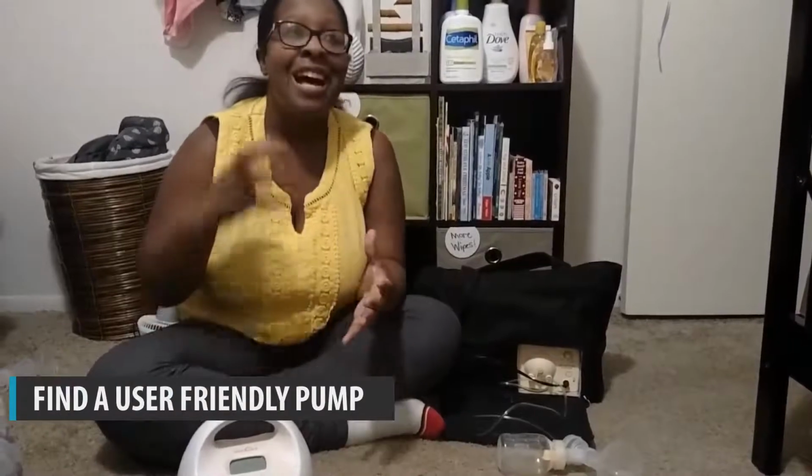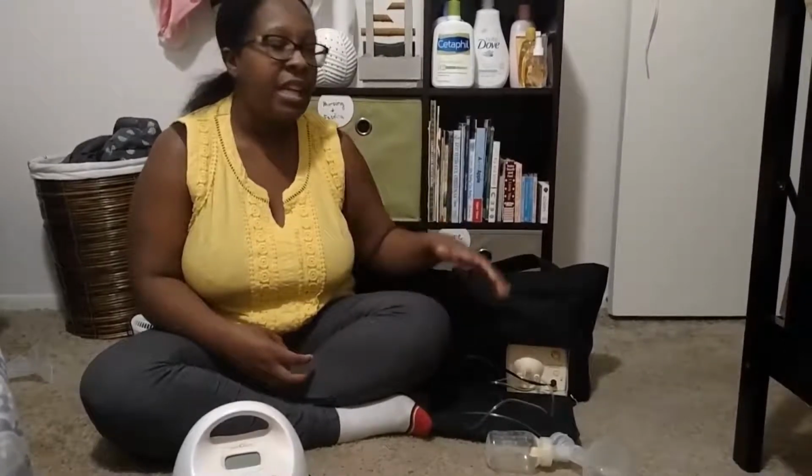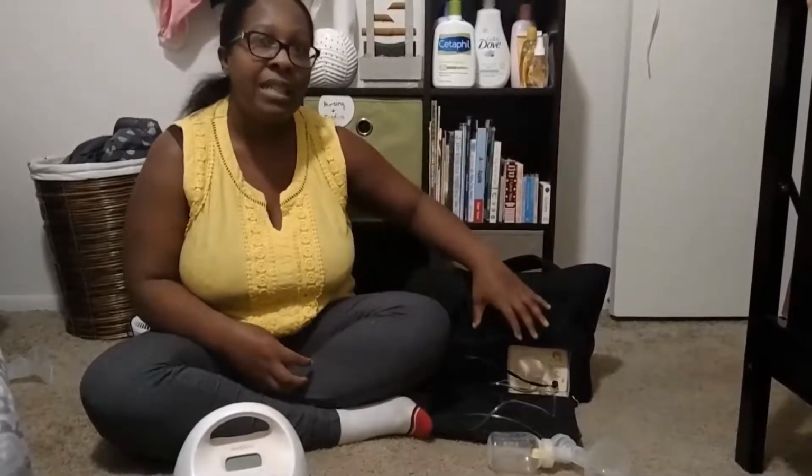Alright, what I also like about my Spectra 2 pump is just how easy it is to use. You want a pump that's fairly easy to use. I will say the Medela was pretty easy to use. They both have a letdown phase, which is really, really nice. It is very similar to what you experience when the baby's actually nursing. So when the baby's on your nipple, they're stimulating it, trying to express that milk, and once that milk is expressed, they stop sucking as fast and they go into what is known as the letdown reflex, where they're swallowing the milk. The Medela is really nice because it automatically does it.